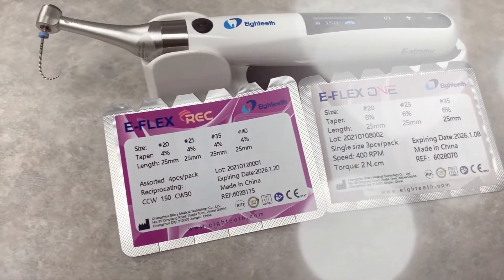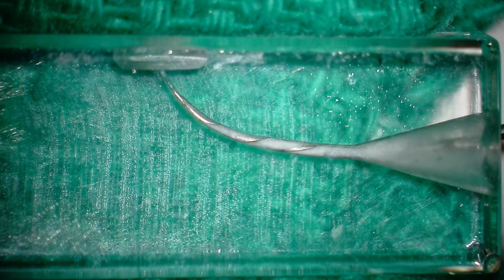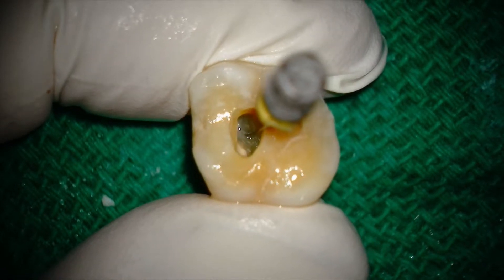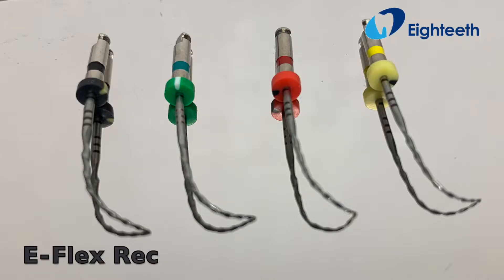Hey, this is Ash from All Things Dentistry. This is gonna be a super fun video as we use the Ultramint Pro ultrasonic unit to find MB2 in this maxillary molar and shape this tooth with both the E-Flex 1 and REC. Let's get into it.